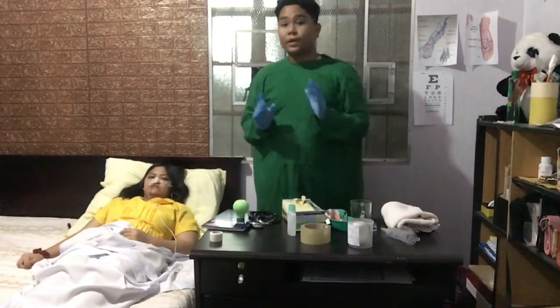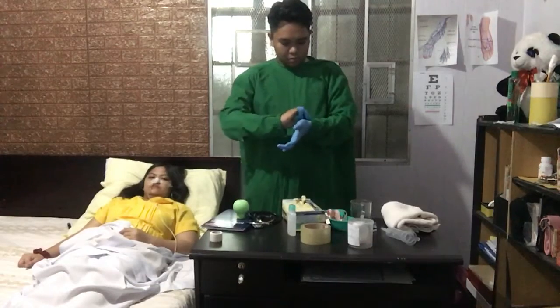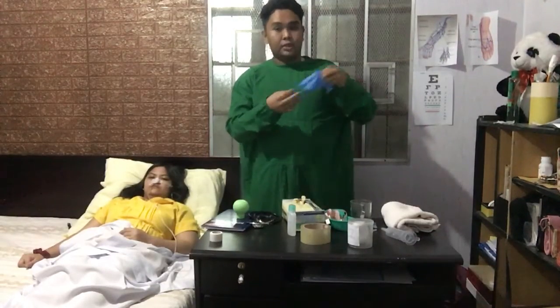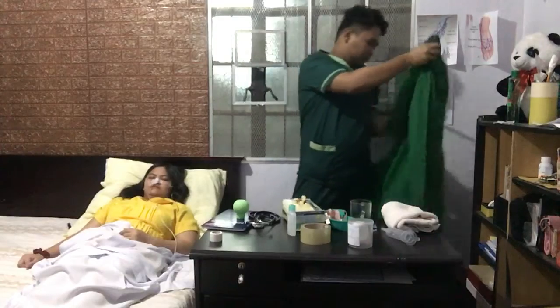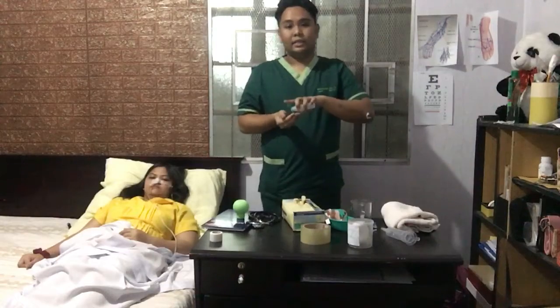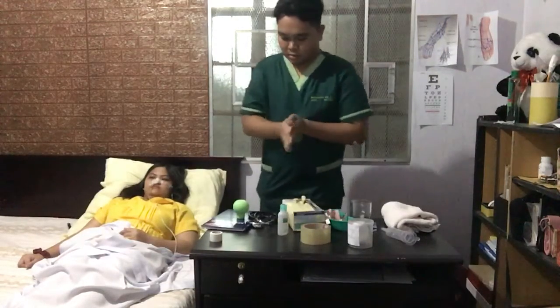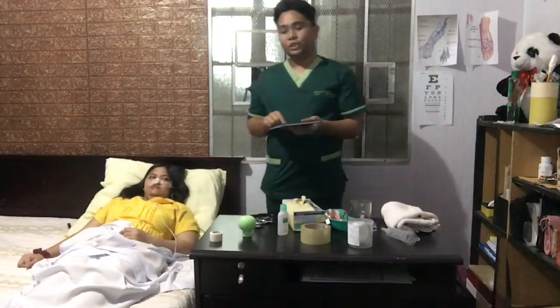Then, wash and clean the equipment that we used, or replace it, according to the agency policy. And then, we remove our gloves and discard them. Then, remove the additional PPE, if used. Then, we perform hand hygiene. And then, we document the procedure that we did. And that's all for NGT feeding.